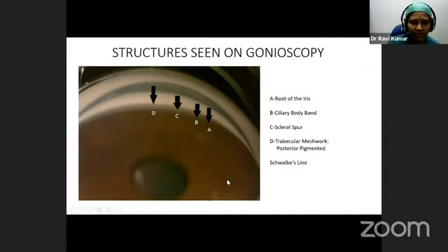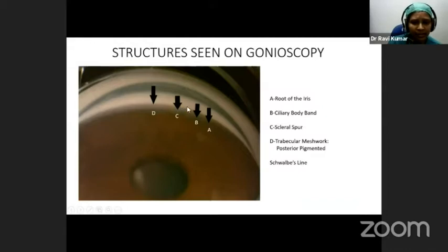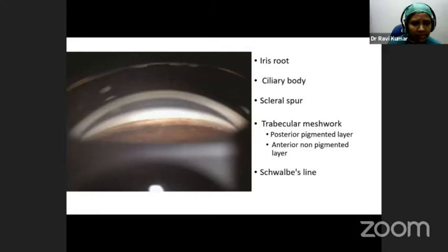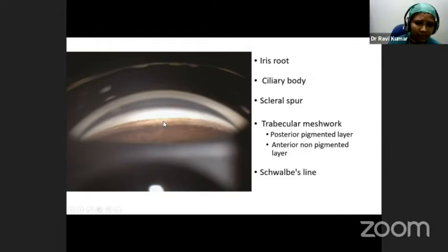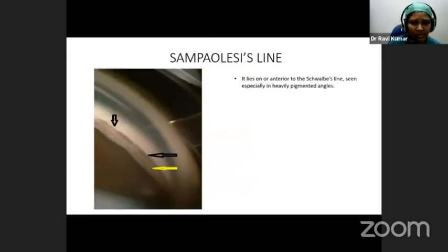When we put a gonioscope into the eye, these are the normal structures seen. The posterior-most structure is the root of the iris, followed by the gray-colored ciliary body band, then the white-colored scleral spur, the pigmented trabecular meshwork, the anterior non-pigmented trabecular meshwork, and then Schwalbe's line. However, the ciliary body band might not be seen in all patients — mostly the scleral spur is the posterior-most structure visible. We may also see a brown wavy line anterior to Schwalbe's line called the Sampaolesi line, which is usually seen in heavily pigmented eyes.